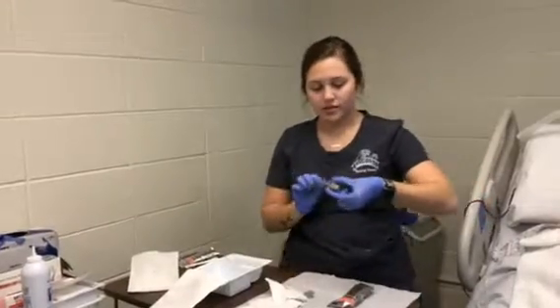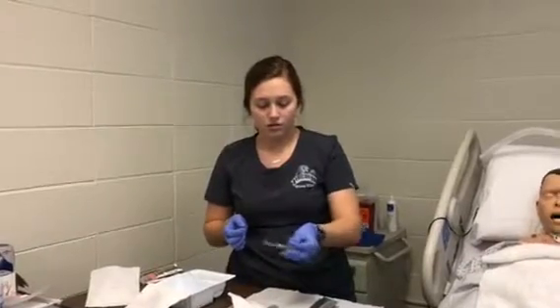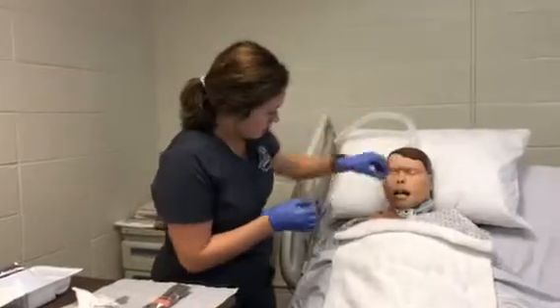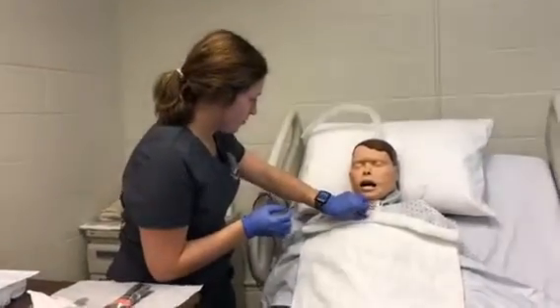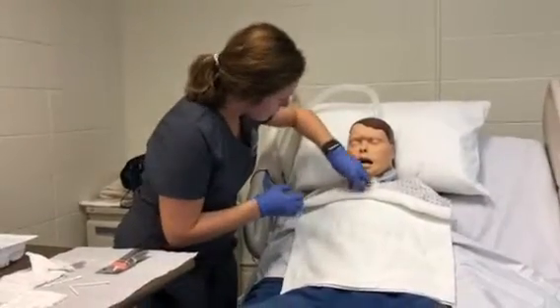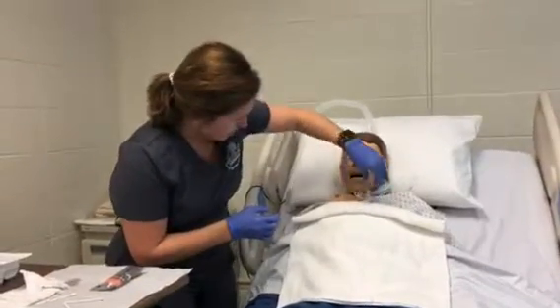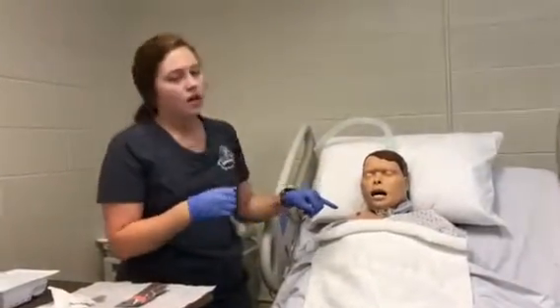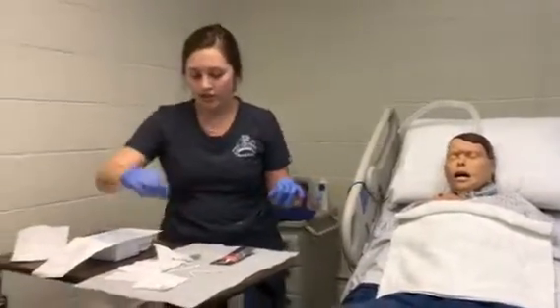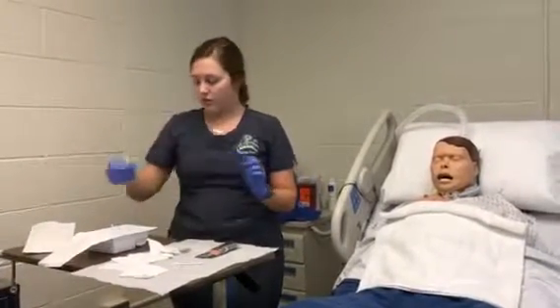Okay, and now that that's clean, we can put that back in. Okay, and now that's back in, I am just going to go ahead and clean under the trach and around it, and it's good to use the cotton swabs for that.